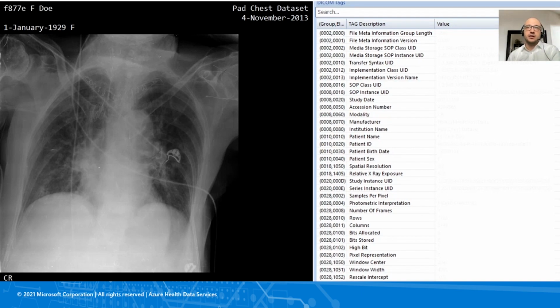The metadata is organized as a constant and standard series of tags that are defined as part of the DICOM standard. You can also add additional tags with our service that help you to index your data much more effectively. But we definitely store the defined set of DICOM tags that are defined by the DICOM standard. By extracting the data from those tags, one can access important information regarding patient demographics, study parameters, and so on. And imaging data is the pixel data that makes the image.